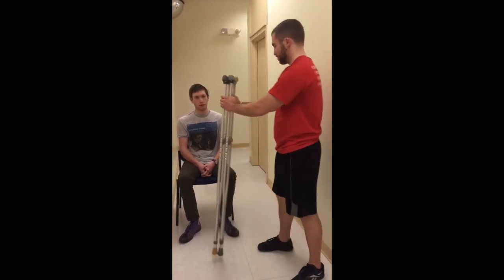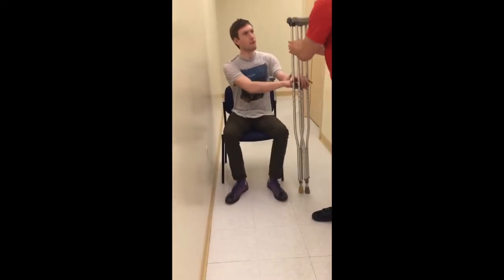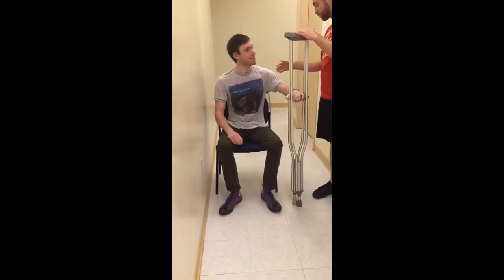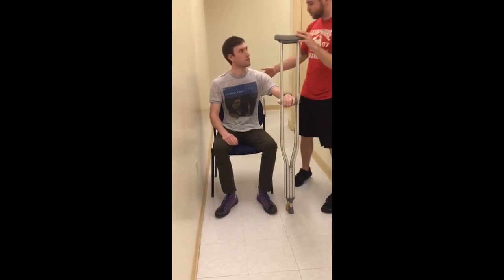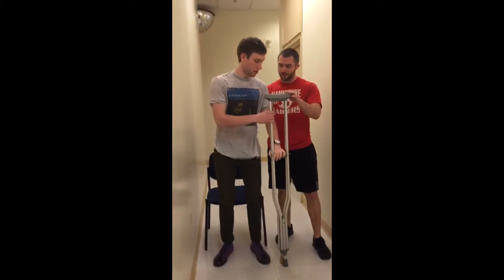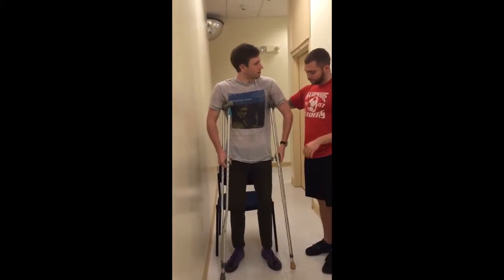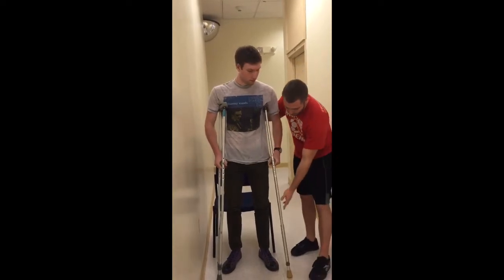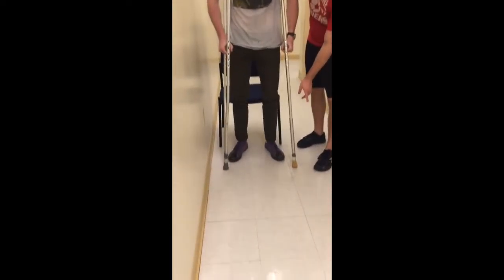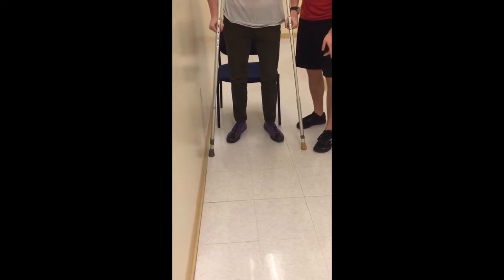Okay? So, Will, I'm going to have you put the crutch on your left hand. And you're going to use it to help you stand up. And you're going to push through. You're going to come on up in standing. Good. Take that crutch, slide it over to that right side. Perfect. Good. And now you're going to want the base of that crutch 6 inches at a 45-degree angle, anterolateral from that toe. Okay?